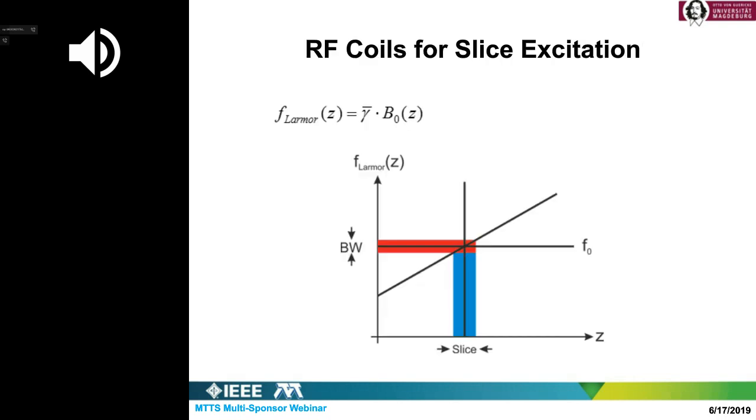Okay, let us see how we can flip. First, maybe some words about imaging and tomography. Imaging in general is two-dimensional or three-dimensional; the one-dimensional is trivial. But if you have three-dimensional imaging and you make it slice by slice, this is what is called tomography. And this is actually what we are doing in magnetic resonance imaging. In German, for example, it's called magnetic resonance tomography because it is done slice by slice.